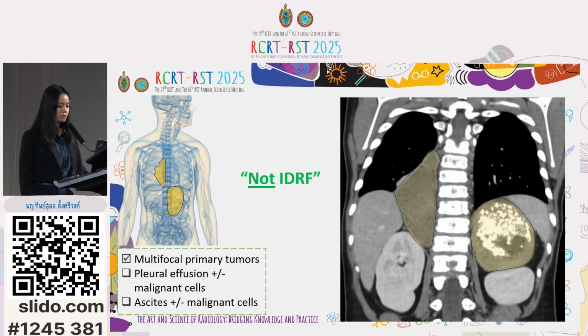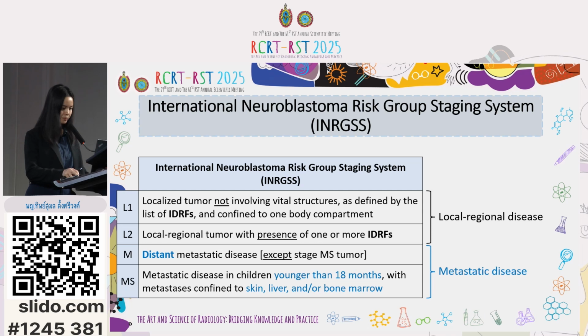Finally, when it comes to IDRF, it's important to report multifocal primary tumors, pleural effusion, and ascites, but these are not IDRFs themselves. For example, this patient has two pathologically proven primary tumors, here and here. Due to the different tumor differentiations, the multifocality of this tumor is not considered IDRF.